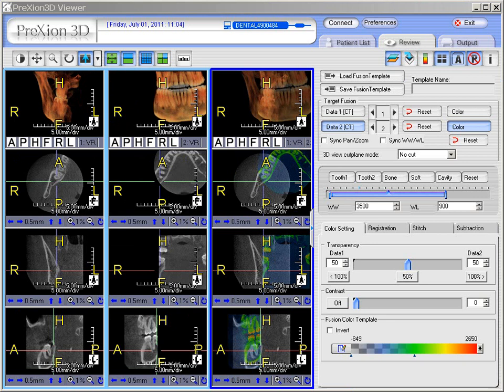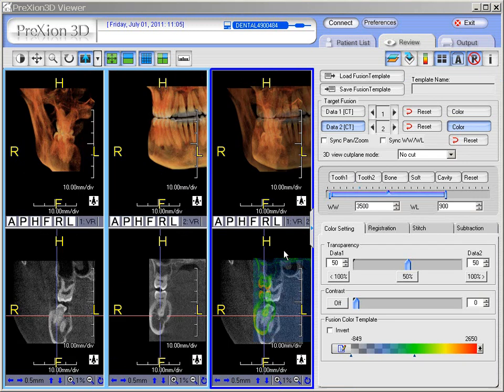Now we're back in the MPR views. Here we'll double-click on the coronal screen and load it by itself. As before, we can right-click on the colored data set 2 and drag it over to align with data set 1.